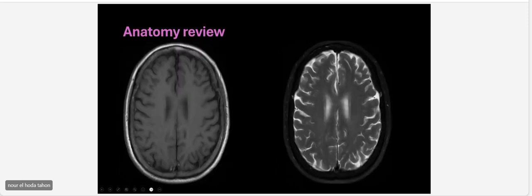Okay, if you go more up, you can see part of the superior frontal gyrus. The middle frontal gyrus appears here, and this is the end of the lateral ventricle, and you can see here the white matter in this area. You can call it the corona radiata. If you go more up, it's called the centrum semiovale, like here.